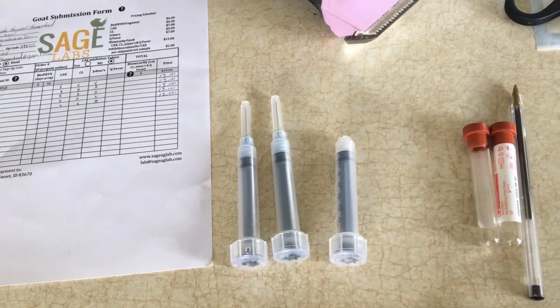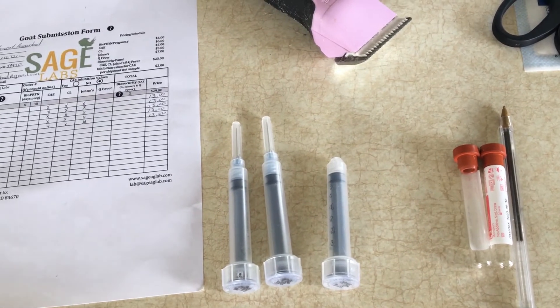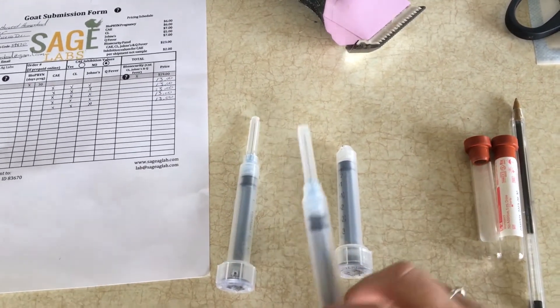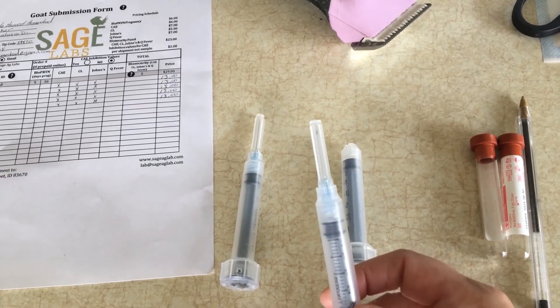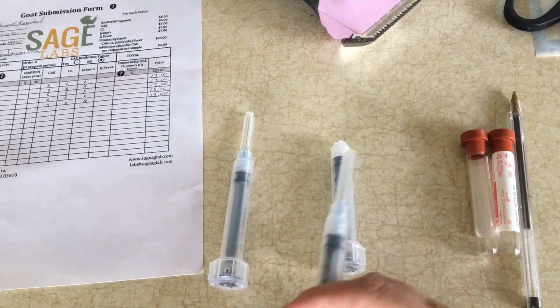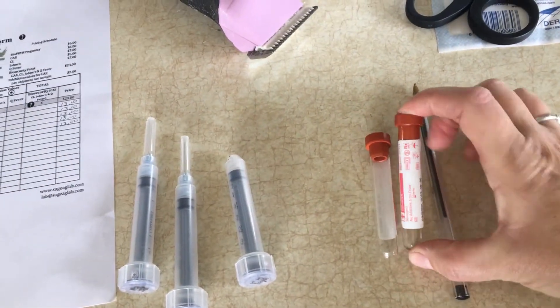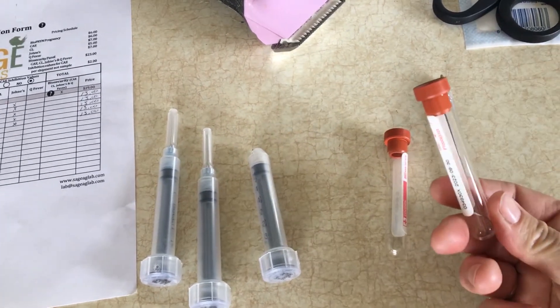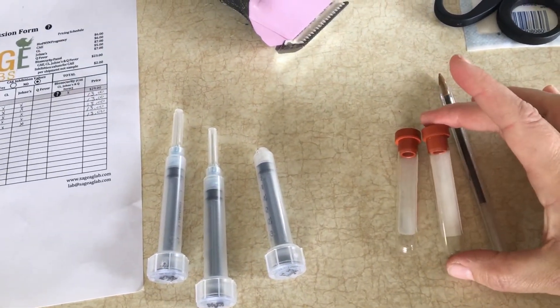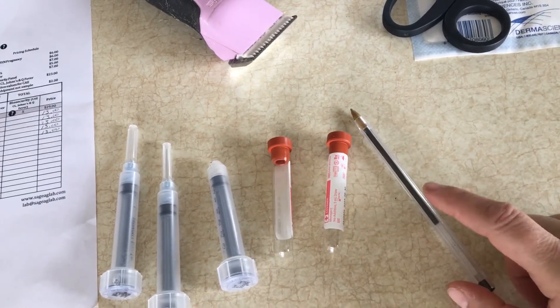I just get these at the feed store. When you're looking at gauges for needles, as the number gets larger, the needle actually gets smaller. So 18 and 20 are getting larger in number but smaller in size. These look like they're probably 20 or 22 gauge — 22 is getting a little small for blood drawing. These are red-top vials, and these are what you're going to send the blood to the lab in.